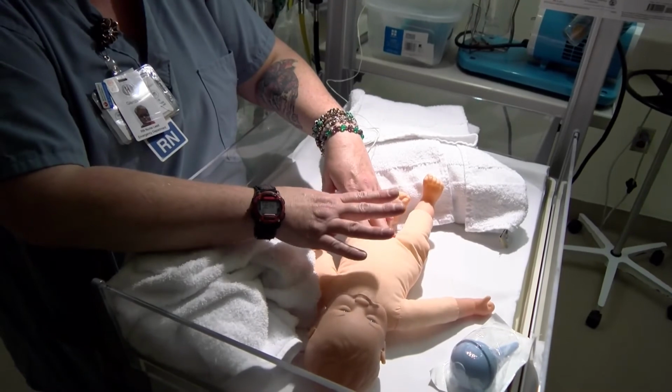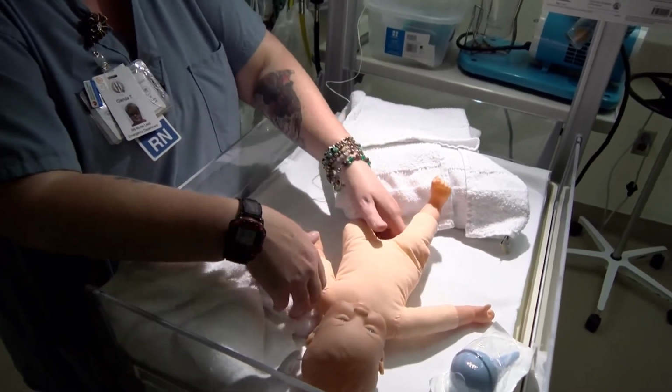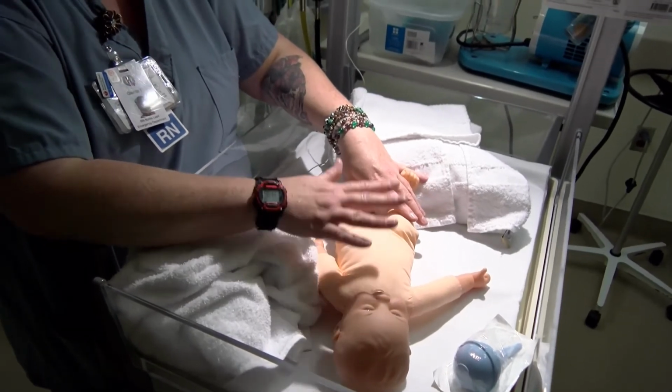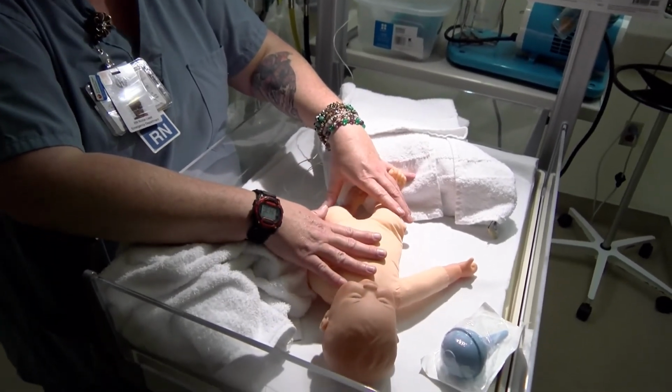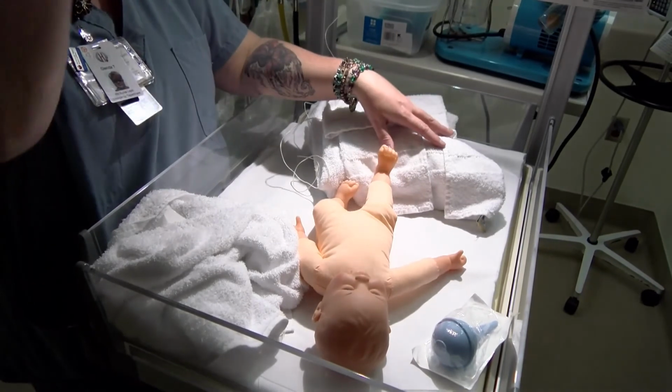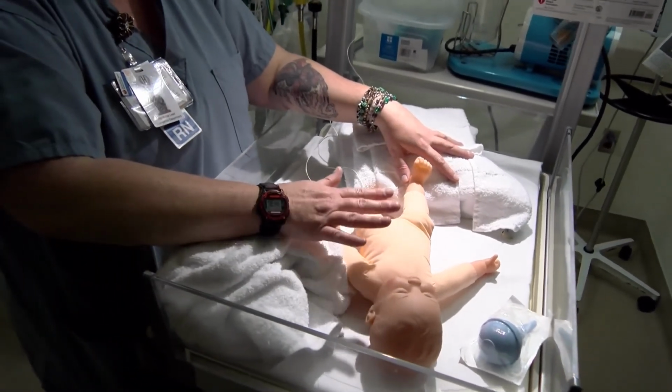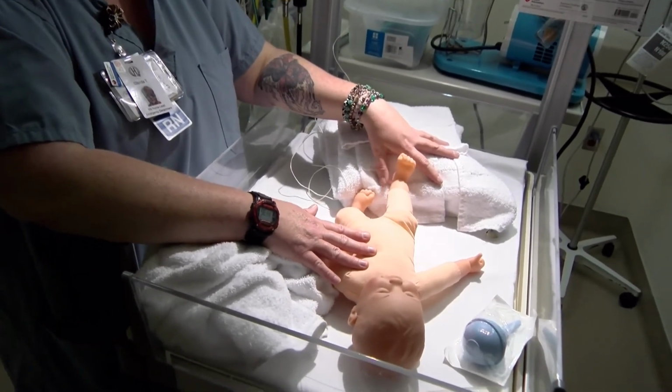After you're done, once the infant is gone from your care, you will need to make sure that you have your Panda Warmer cleaned by housekeeping. They will have to take everything apart, wipe everything down, throw away the disposable equipment, and make sure you restock your Panda Warmer for the next time for use.